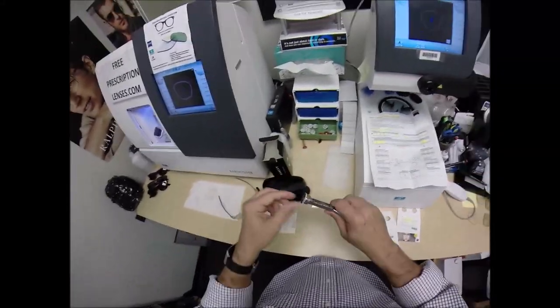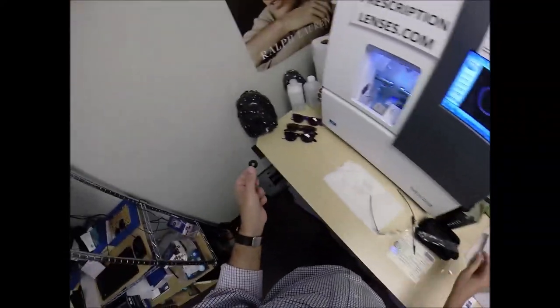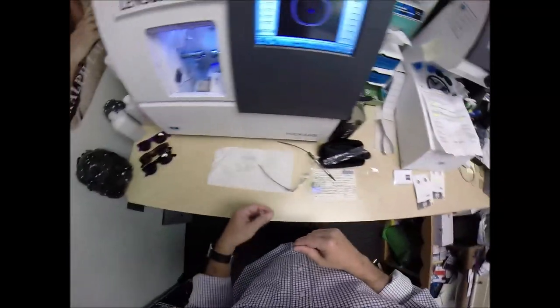I'm going to take this block off, pull the sticker aside, use my hand-approved drying method, throw that back in there, add to my sticker collection.